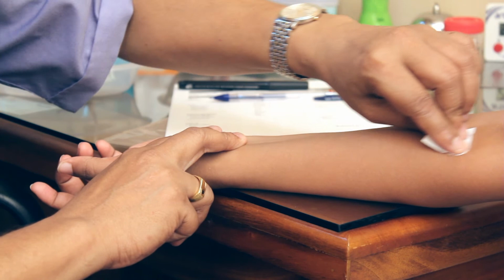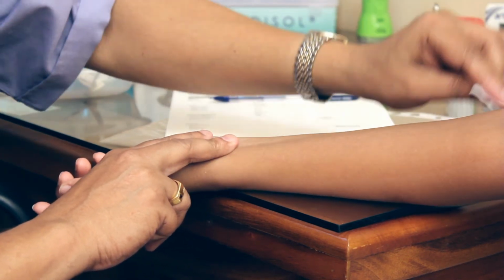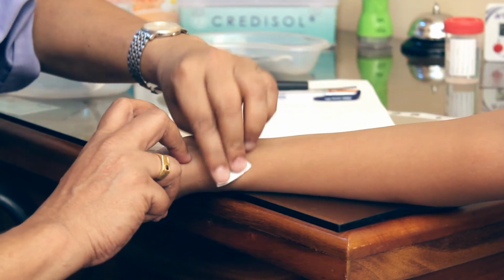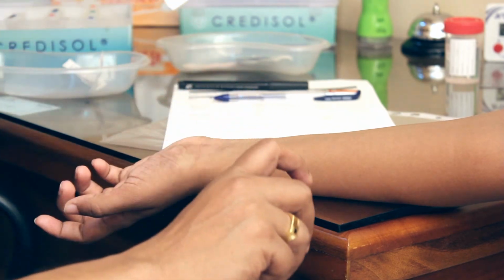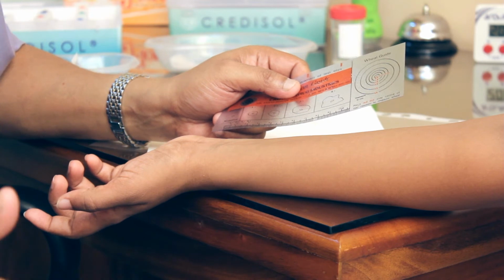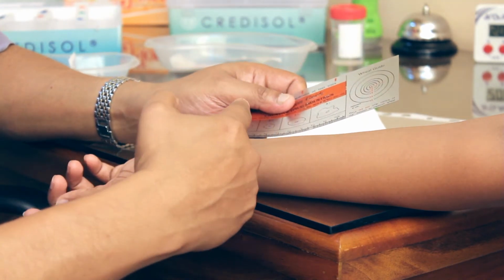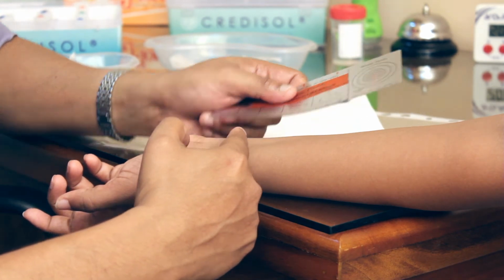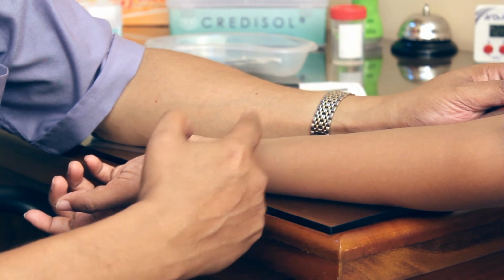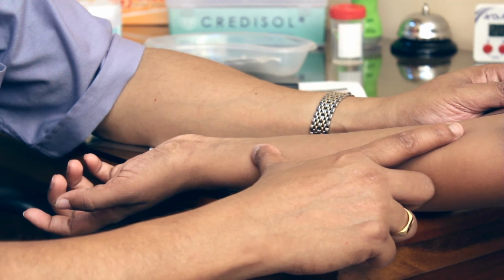First, you have to clean the patient's arm with an alcohol swab. This is the measuring tape that we use to measure various things during this test, and you have to leave about 2 centimeters from the wrist joint as well as from the elbow joint, and the rest of the space is used to do the allergy testing.